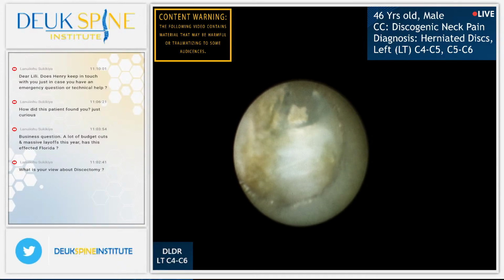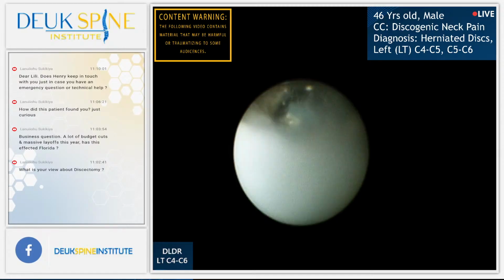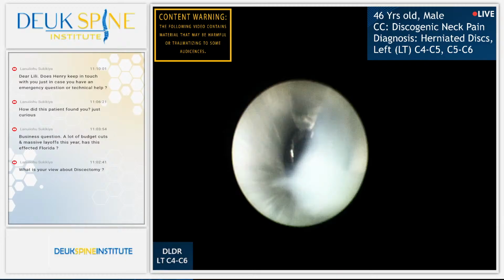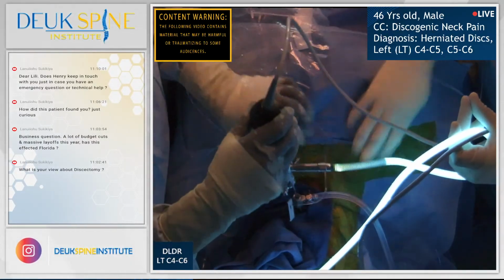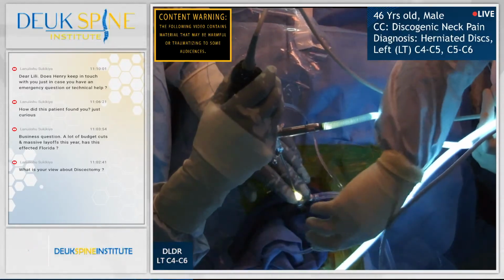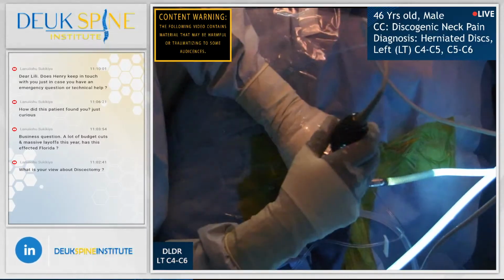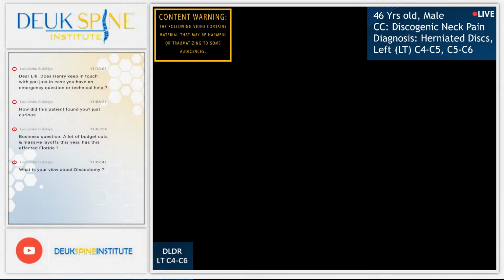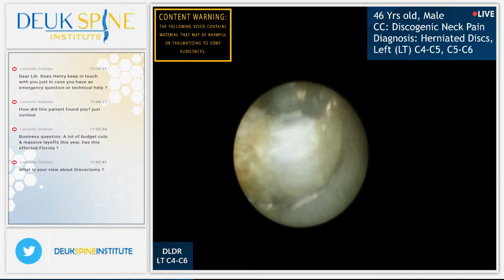All right, look at that tear. Look at that herniation. Oh, here it comes. Here it comes. All right, there it is. That's a herniation that literally I just released off of his spinal cord. It was pushing on the spinal cord. This is at C5-6. And when the laser's working perfect, there's another herniation right there. See that? The spinal cord down there? Okay, so this herniation was literally sitting on the spinal cord.